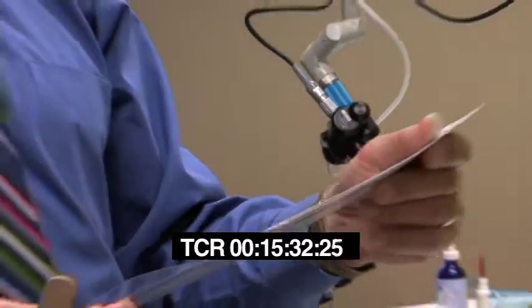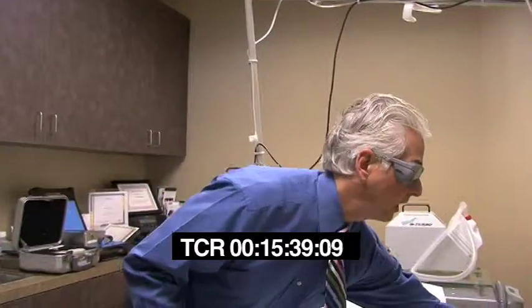Now, how long have you been doing this kind of process? Well, the fractional CO2 laser, I've been doing it for about a year and a half. The laser came out a little over 2 years ago, and a few of the other companies have made fractional CO2 lasers, but they're certainly not as powerful as this one.